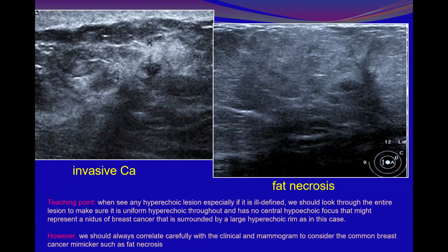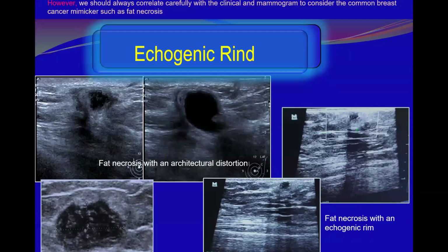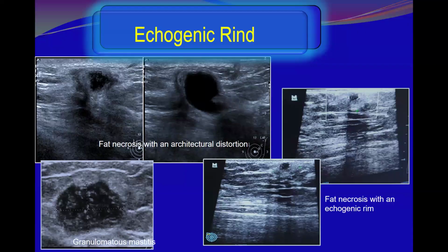However, we should always correlate carefully with the clinical findings and mammogram to consider common breast cancer mimickers such as fat necrosis.